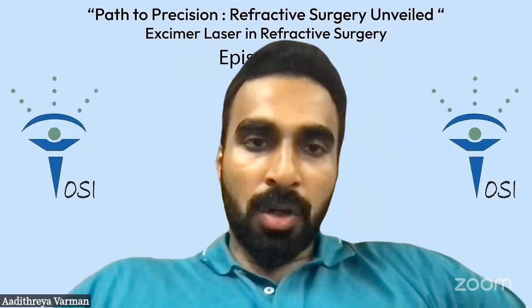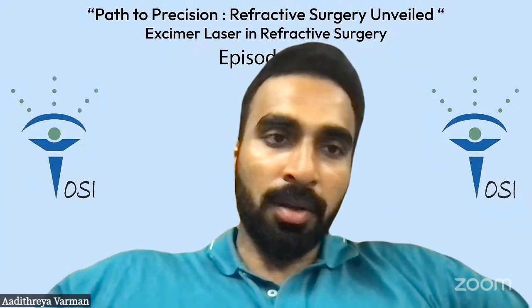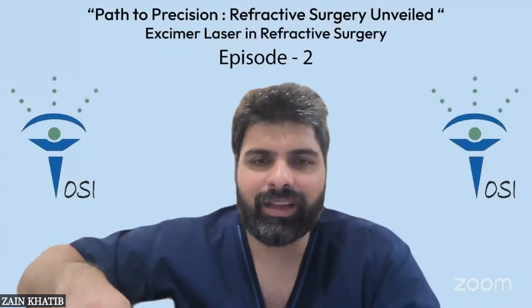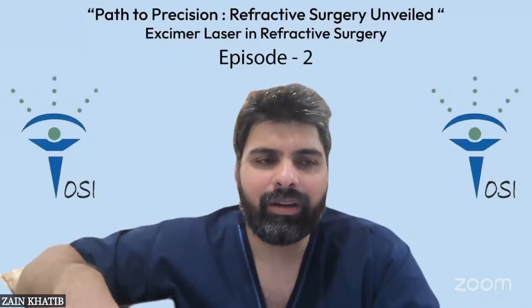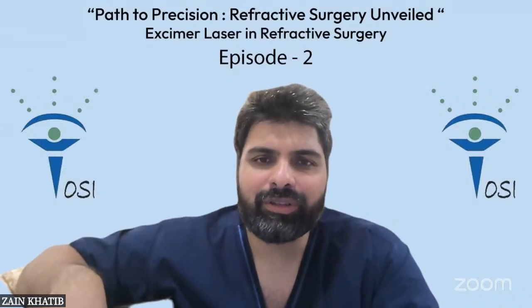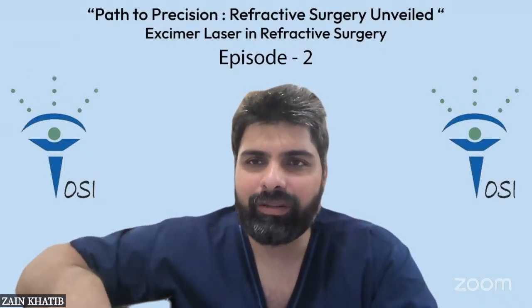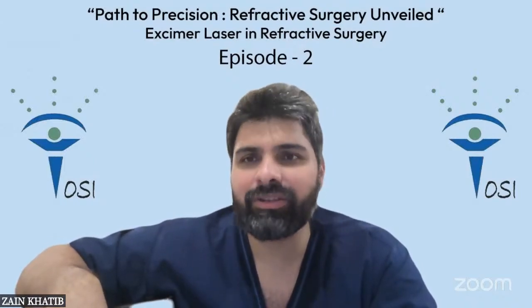Zain, I know you do monovision for your patients. Can you tell us about your experience and how happy they are? Yeah, so what I feel is that what Dr. Pooja said is absolutely right. Most of the procedures are quite similar and they have their pluses and minuses. But I think each and every procedure requires that small amount of monovision, whether it is Presbymax, Presbyon, whatever. And to do a good monovision tolerance test, as Dr. Sushmita showed, is extremely important.